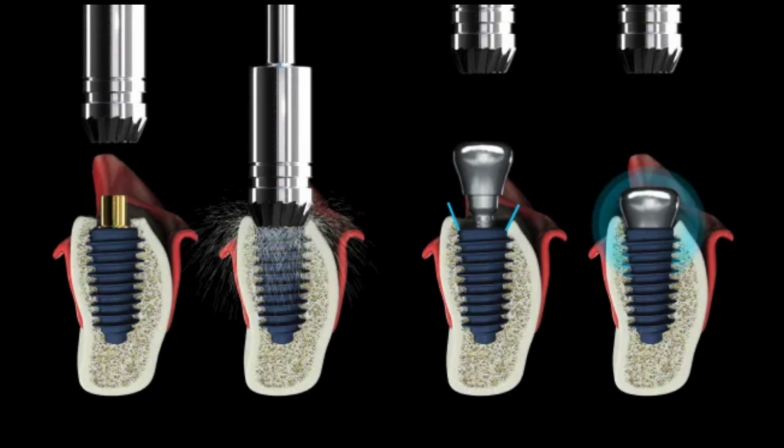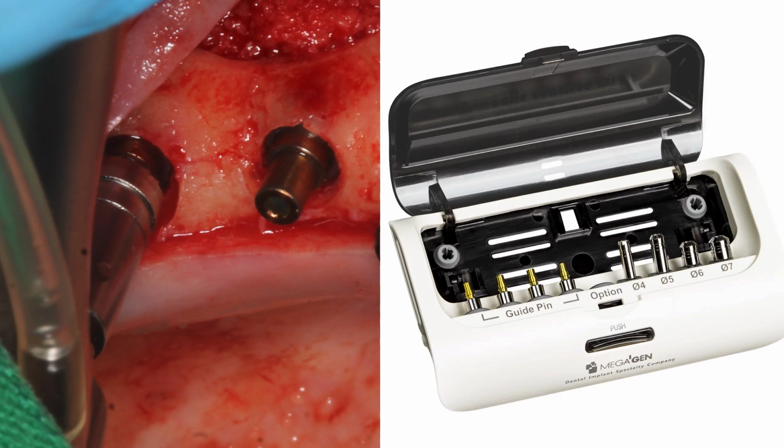And when you rotate the drill, of course, the bone will be profiled at that exact predetermined angle and gap. And therefore, the healing abutment of the right size configuration can be placed, and the surgery can move on in a very expected, predictable way.